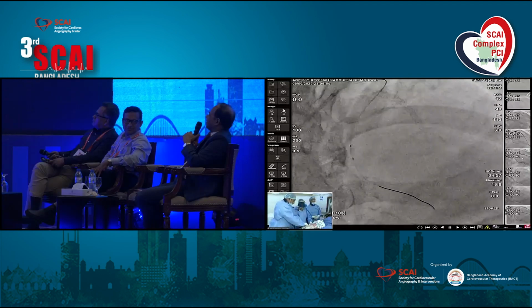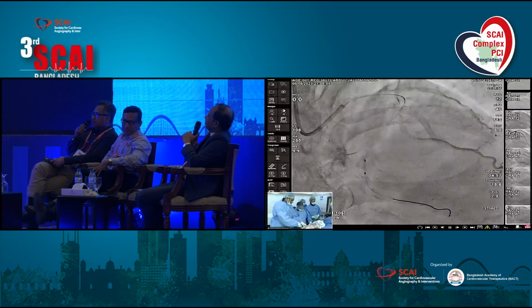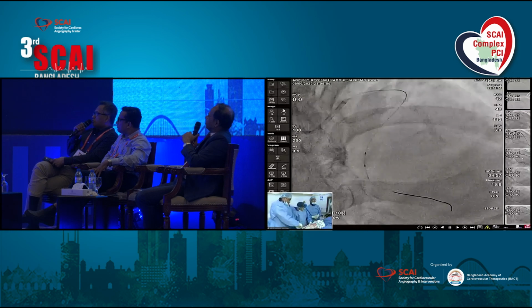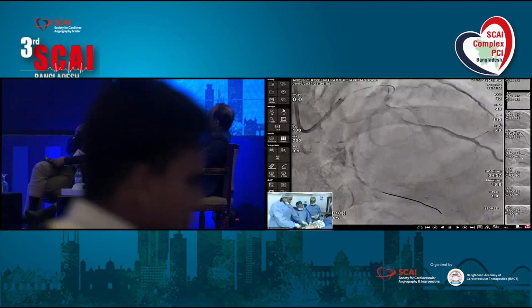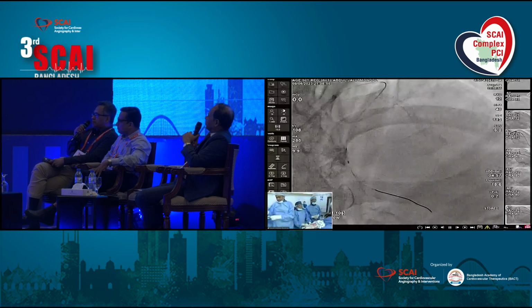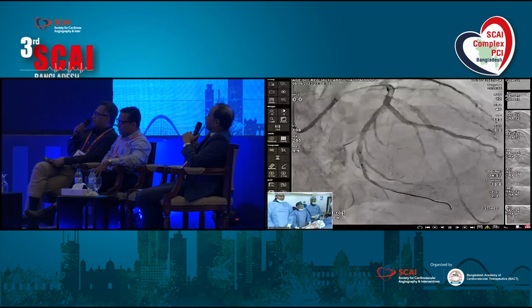How many? Our DCB is up to 30. But is a dominant vessel stentable? Up to 30. Dr. Pradeep, all right, yes, but it is a dominant vessel and stentable. Why should you go for DCB? Because it is a distal vessel with diffuse disease.